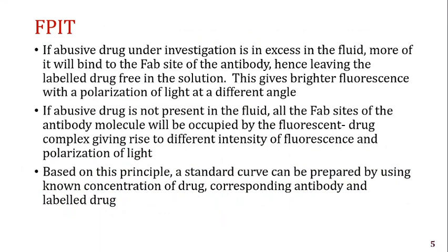The abusive drugs under investigation, if it is in excess in the fluid, more of it will bind to the FAB site of the antibody, hence leaving the labeled drug molecule, that is molecule bound to the fluorescent probe, free, and that fluorescence will be brighter, as I mentioned earlier.